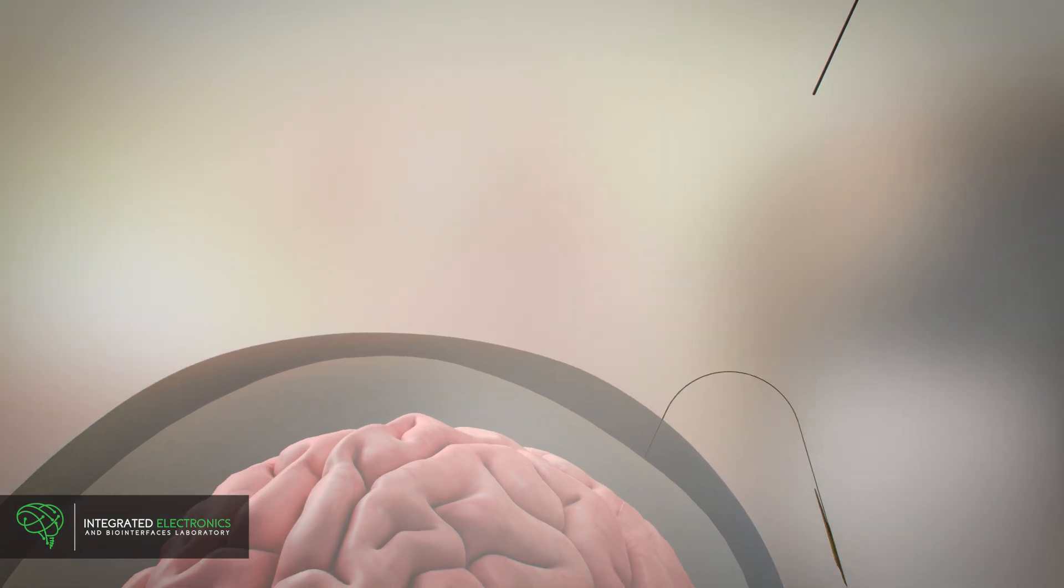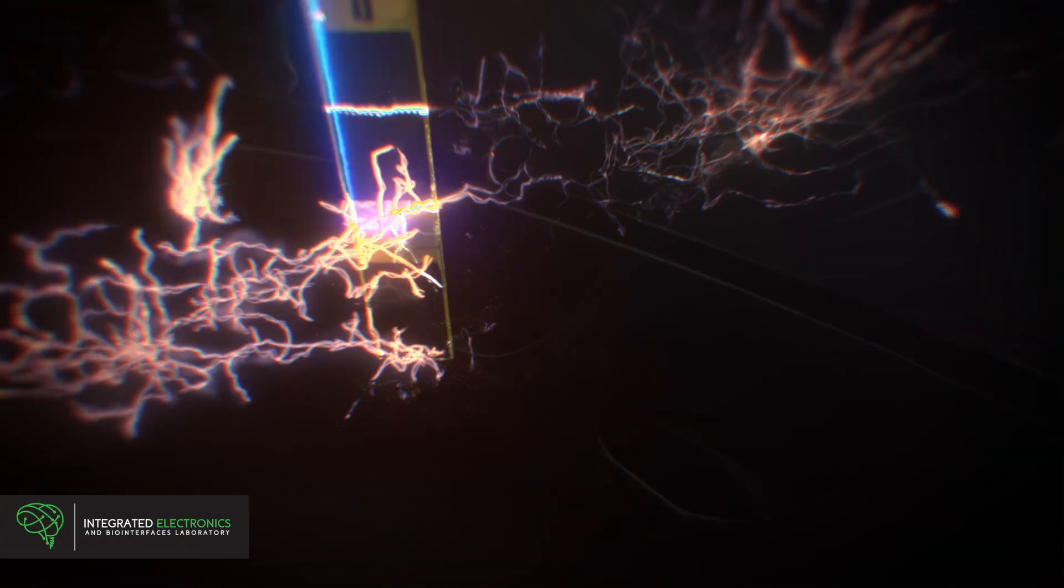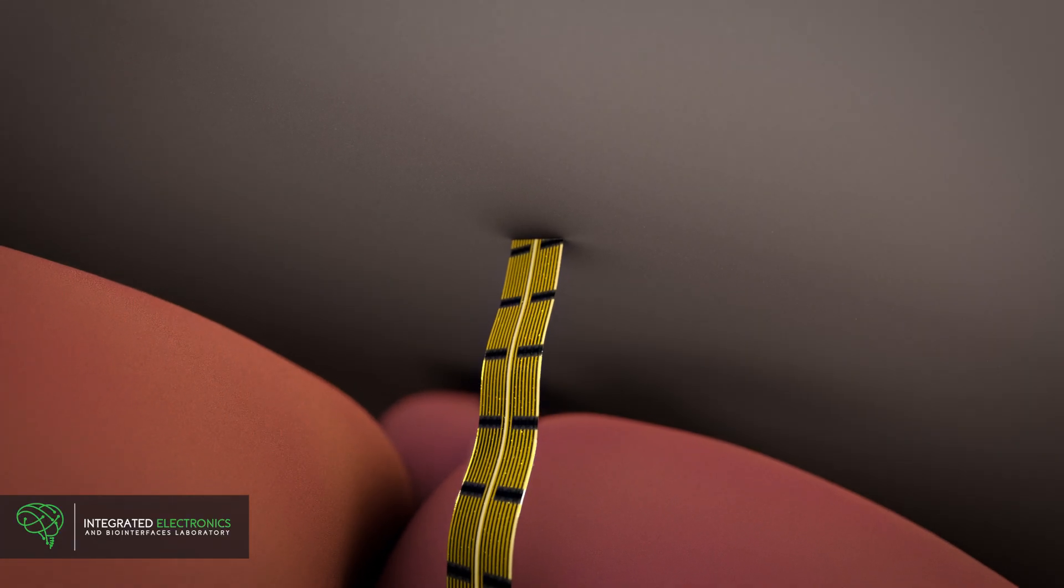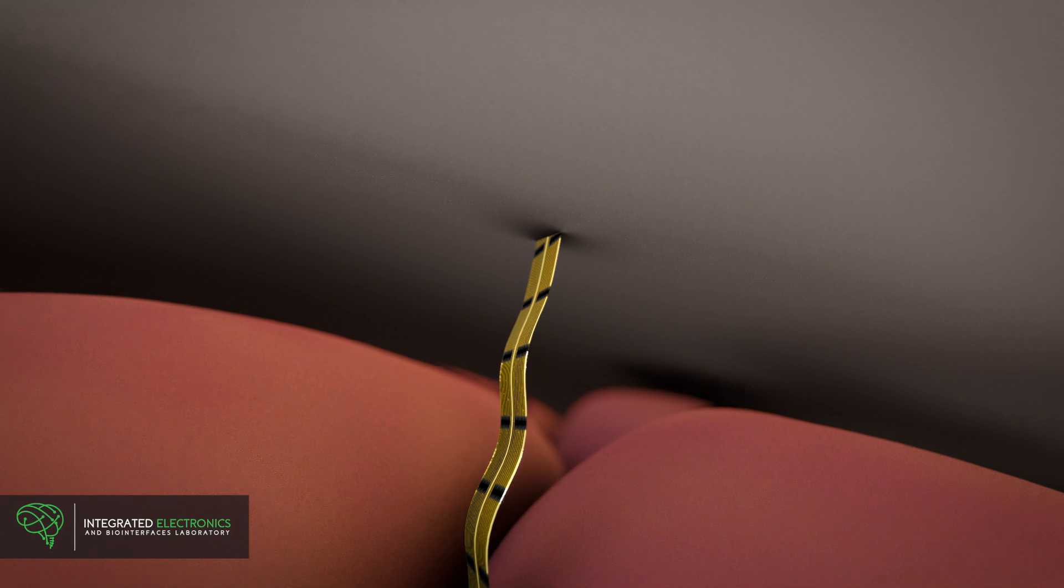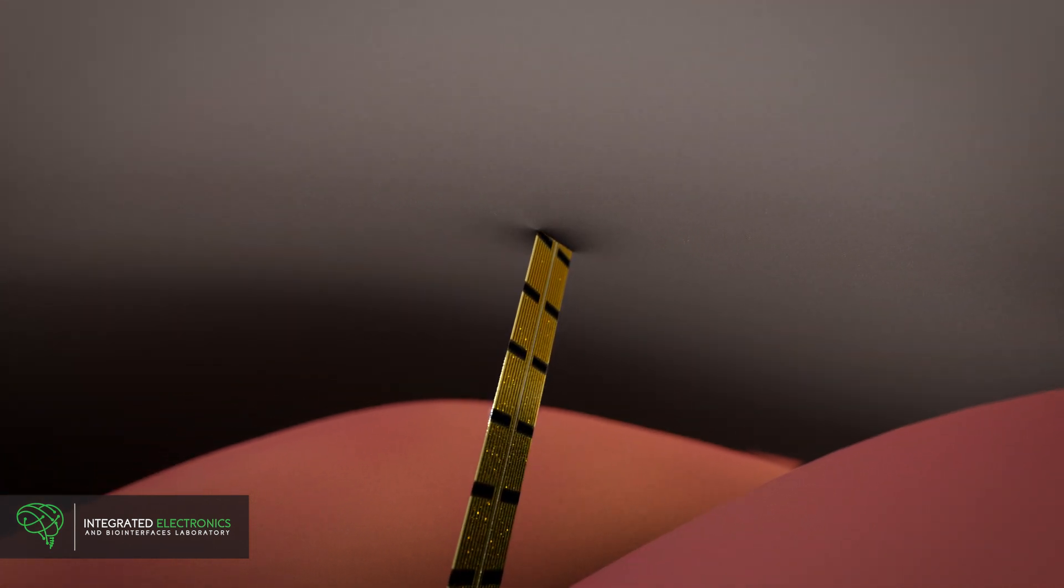After implantation, the stylet is retracted, leaving the flexible thin film in the brain and minimizing damage. Its light weight and flexibility ensure high-quality recordings without motion artifacts, as it moves with the brain's natural pulsations.